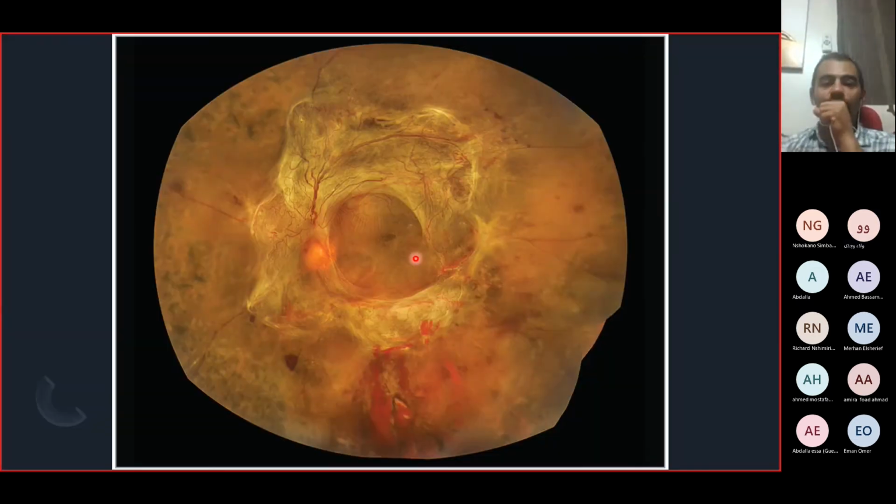If you use horizontal scissors and separate the membranes from the retina, this is called delamination. So you delaminate the posterior hyaloid from the retina using horizontal scissors. If the adhesion is very strong and you cannot delaminate it, go and segment it. Segmentation is done with vertical scissors. So you cut this membrane into pieces so that the pieces are not pulled together, and this will relieve the traction. This point will relax a bit like here, this point will relax here, and this will decrease the traction a bit. Okay?